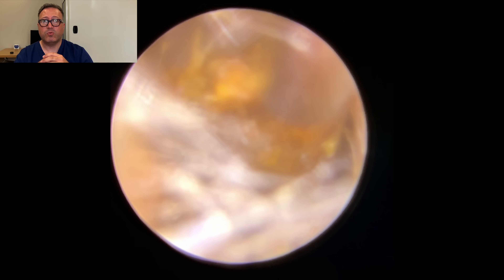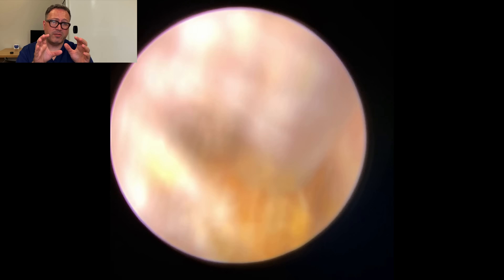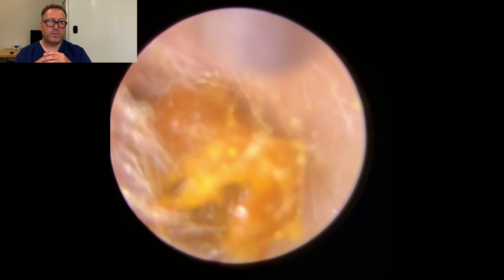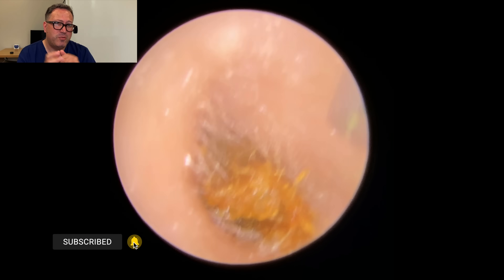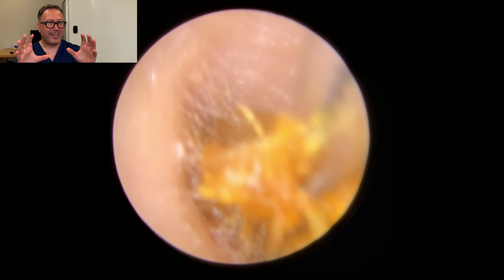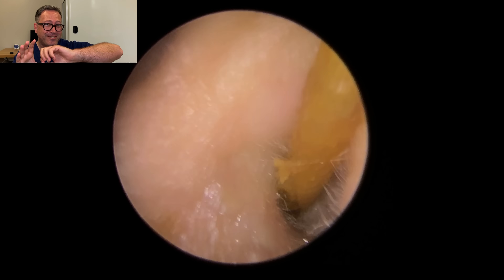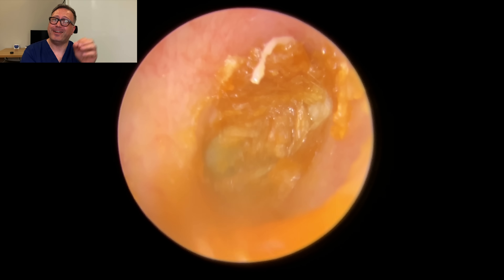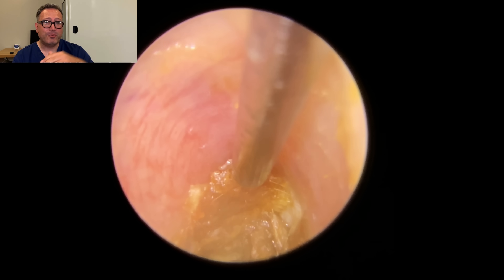We've got it moving towards the outer part of the ear canal now, just going to try and wiggle it into view and work it down the canal. It's a bit too big to work down, so we're going to get the crocodile forceps on here now. Get a good grip — look at this coming out. That is a great skin ribbon — look at this one, it's still going. As you can see, just literally just filmed it — look how long that piece of skin is. Absolutely epic. The page was laughing because it was such a long piece. We'll show you it at the end laid out on the ruler.